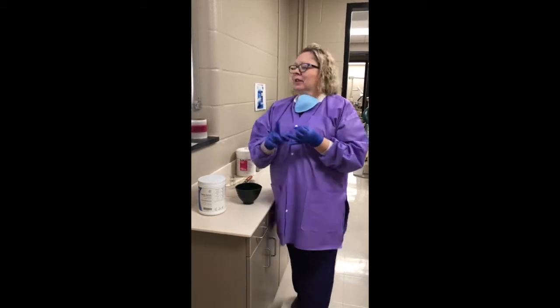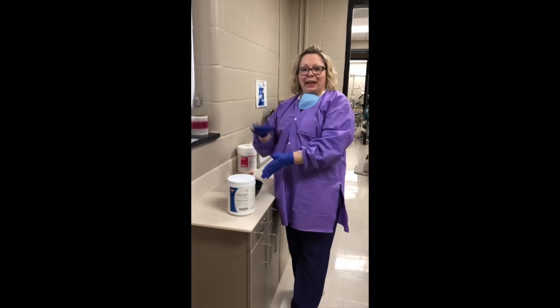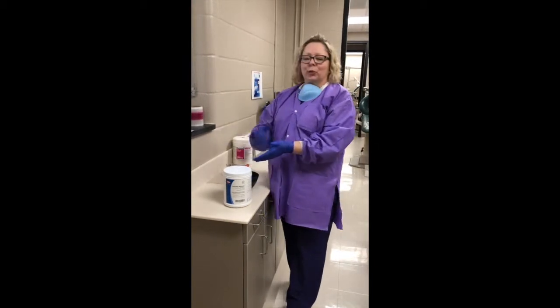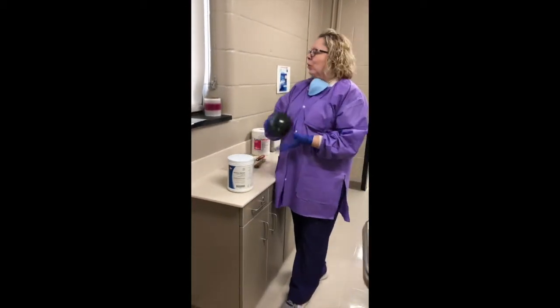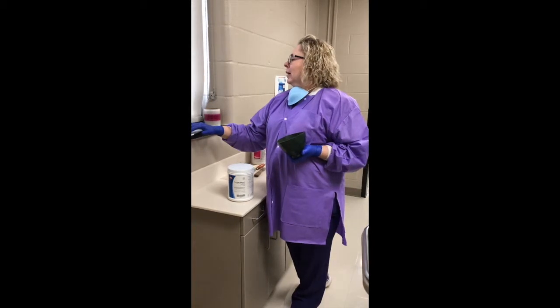The second thing is to learn how to fluff the material and measure it correctly. And once you get that in the bowl, then you're going to add the water and begin spatulating it as you should, back and forth with the bowl on its side. And that helps to mix it properly.